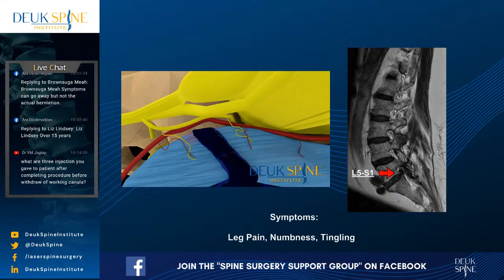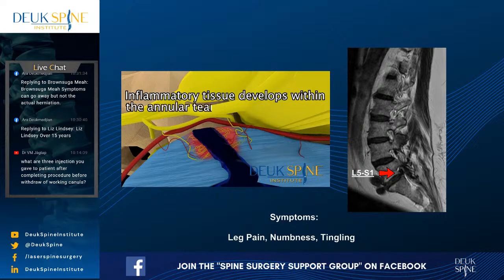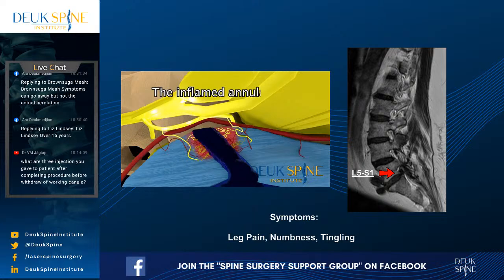2021. This is Dr. Ara Deukmedjian, CEO and founder of the Deuk Spine Institute. We're getting ready to broadcast live spine surgery. This morning we're going to be performing a procedure called the Deuk laser disc repair, which is endoscopic spine surgery.